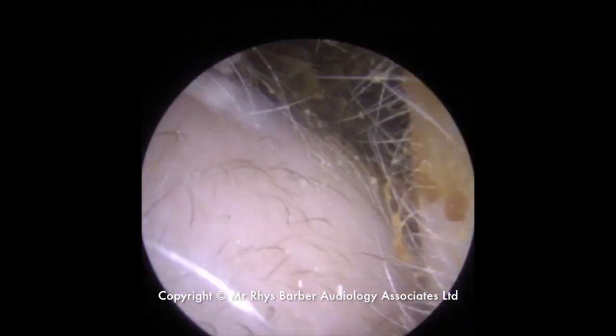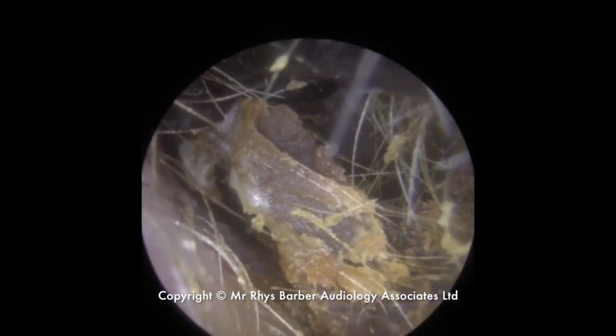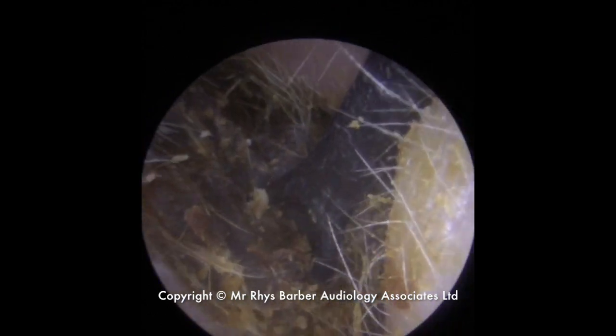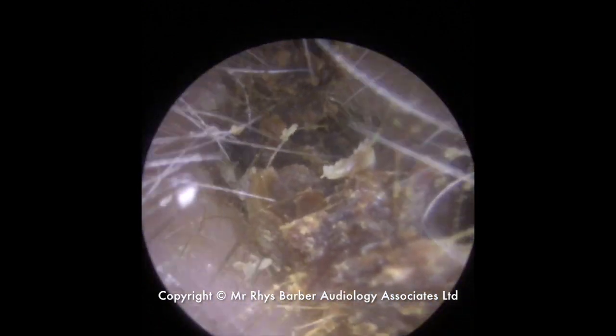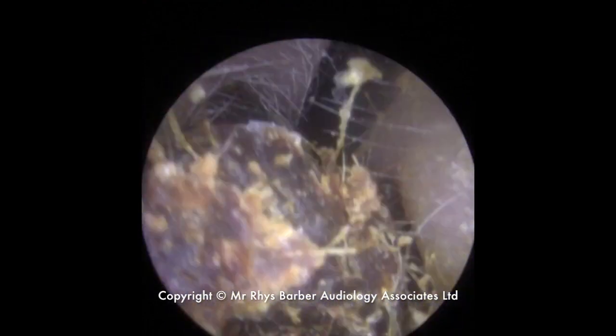Just scraped on the outer edge of it there. We didn't get very far behind it, so just going to go in, up and over the top. You can just see this section is much harder, much tougher wax. It all looks like it's coming away in one big chunk, so we've got a grip on the outer edge to bring it forwards. We're going to go over the top of it again just to try and roll it out of the ear canal if we can. I've got behind it now. There we are. You can just see it starting to come out.